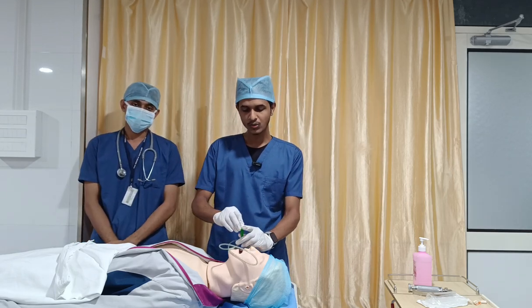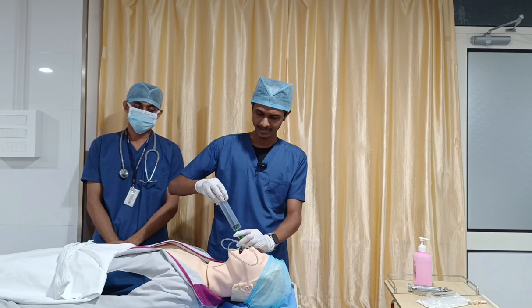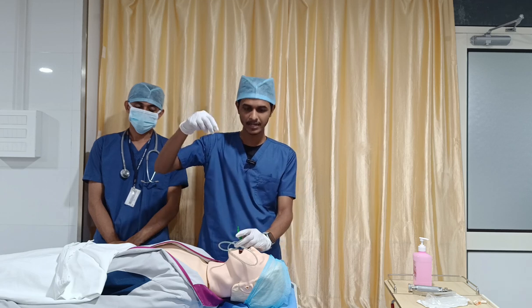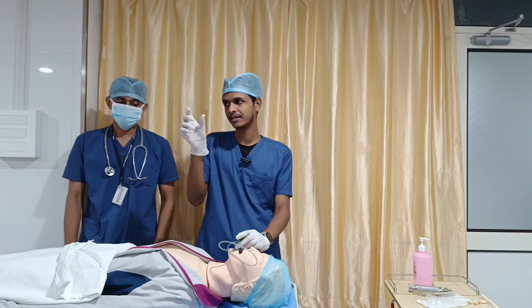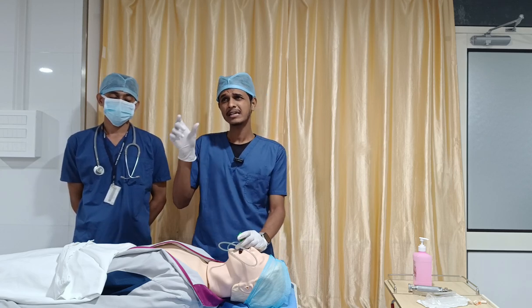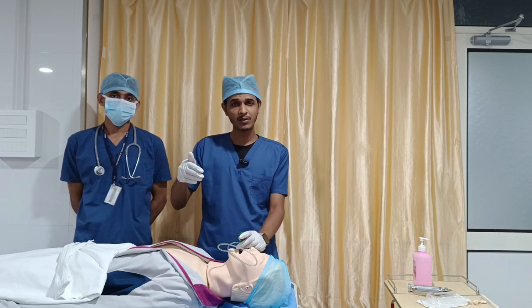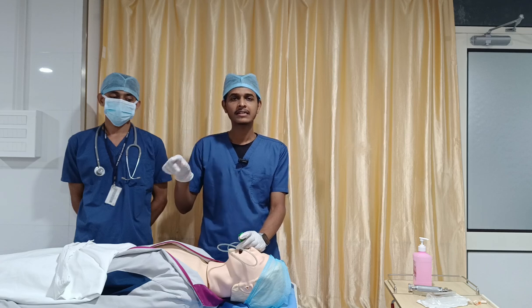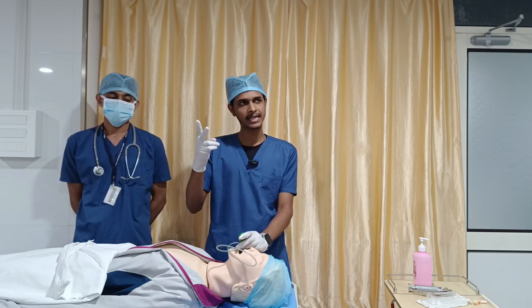Or else you can take out the gastric content, thereby you can check it on pH paper. If you have a pH paper, you can apply the content to it, and if the gastric content is acidic, thereby you can also verify. But here also the accuracy of the test is questionable, because if the person is taking any antacids or proton pump inhibitors, you won't get any acidity on the pH paper. That is the second thing.